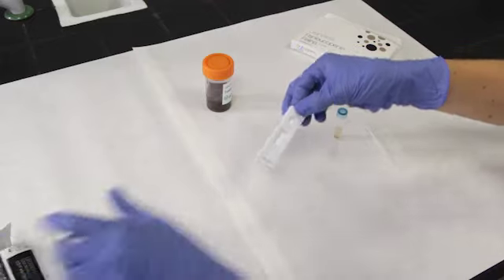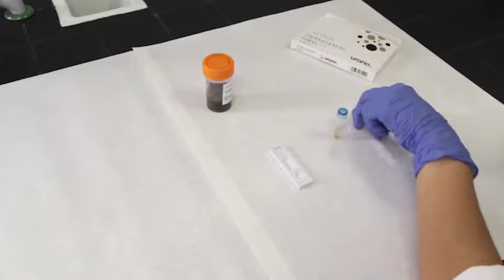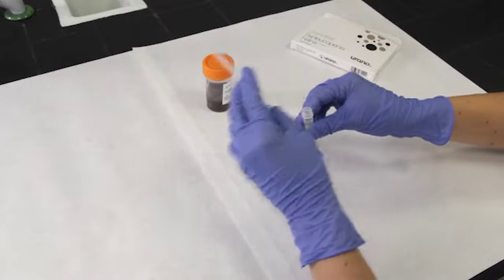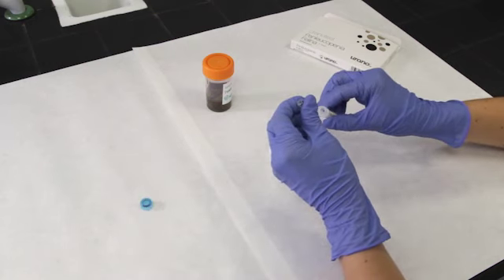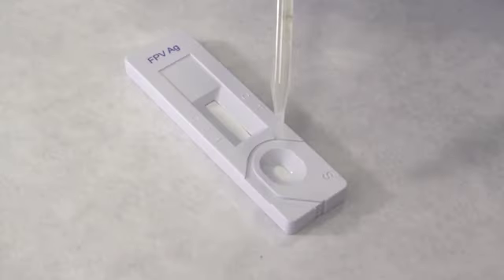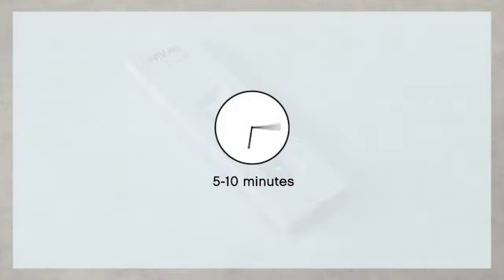Take the test out of the aluminium packet and place it on a flat, dry surface. With the aid of the pipette supplied, take 4 drops of the mixture and place them on the sample hole. The sample must be deposited gradually and precisely, drop by drop. Interpret the results after 5 to 10 minutes.